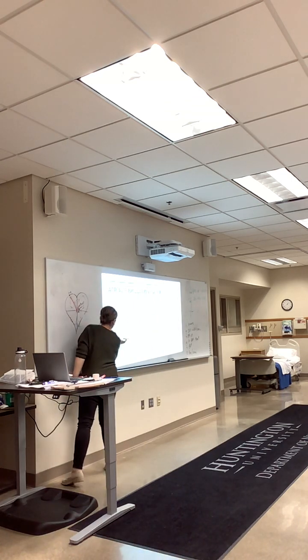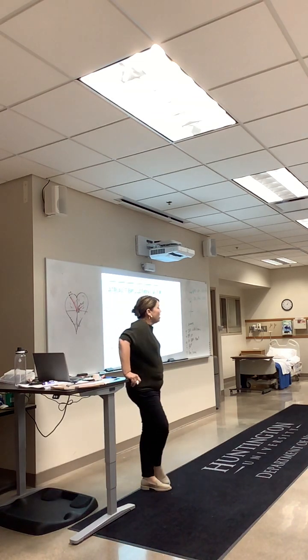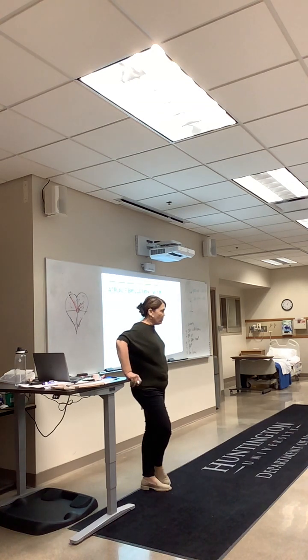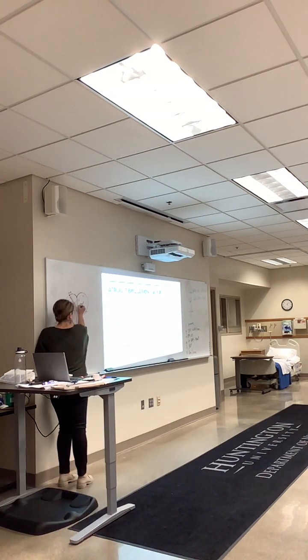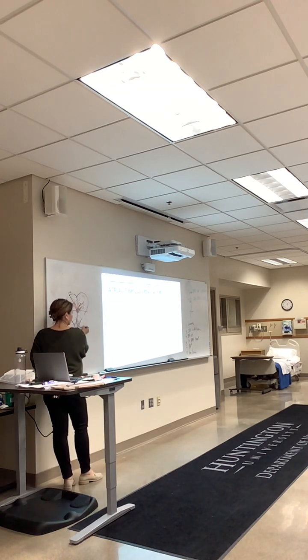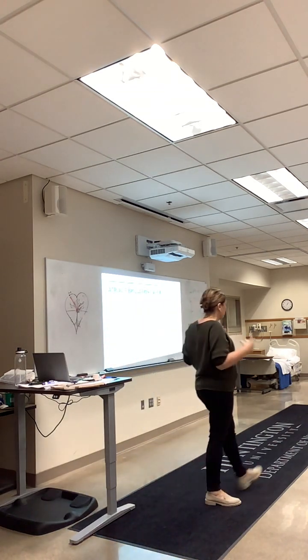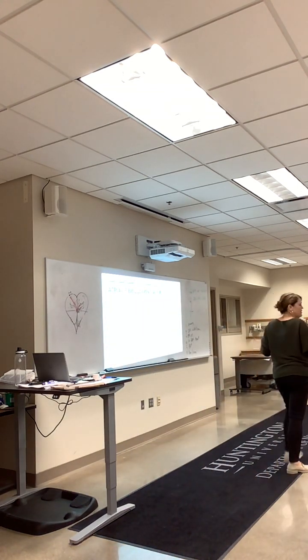For every one of these, it's hitting a signal. The AV node is like, whoa, that's too many. Not that many can fit through the crowded door. I can't send that many signals through. So every once in a while, all these signals come through, causing this wavy line, but then a signal will get through. The AV node is like a gatekeeper and will only allow so many signals through. Thank goodness.